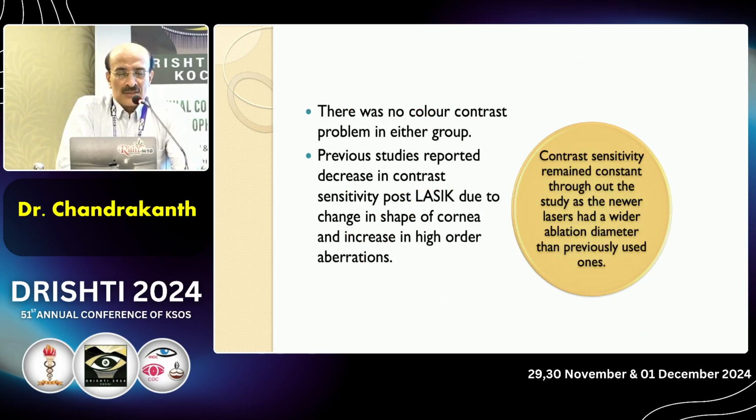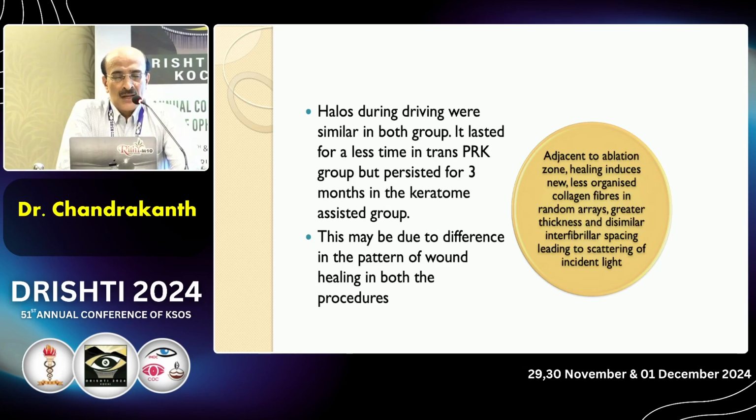There was no color contrast intolerance in either group. Previous studies reported decrease in contrast sensitivity post-Lasik due to the change in the shape of the cornea and increase in higher order aberrations. But here, the contrast sensitivity remained constant throughout, as the newer lasers had a wider ablation diameter than previously used ones. Halos during driving were similar in both groups. It lasted for less time in the trans-PRK group, but persisted for 3 months in the keratome-assisted group. This may be due to differences in the pattern of wound healing in both procedures.